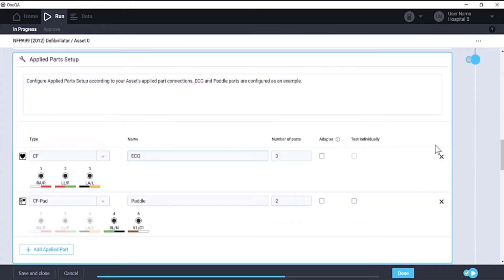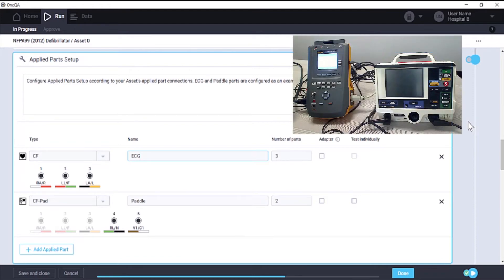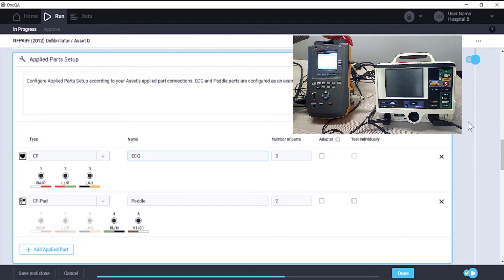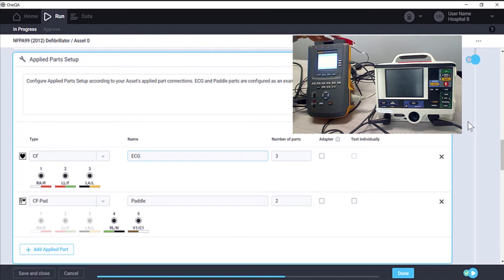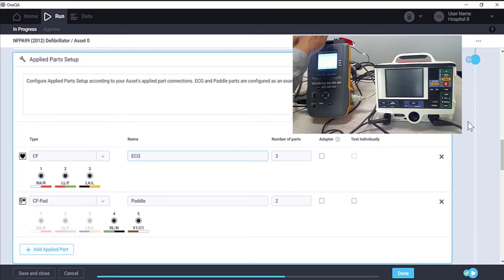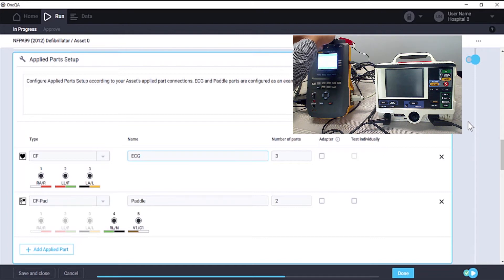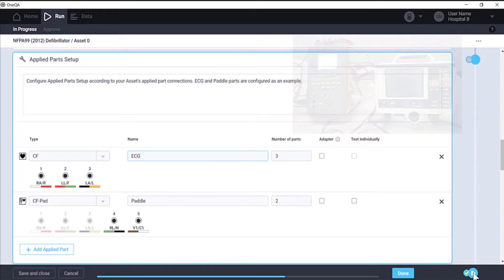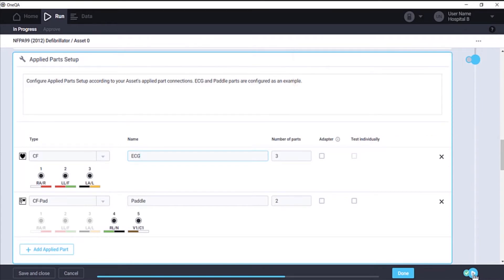The next component is for applied parts configuration. In this example, we have three ECG leads and two paddle leads from the defibrillator, which will connect to the ESA as well. Once connected, we can begin auto sequence with this play button here.